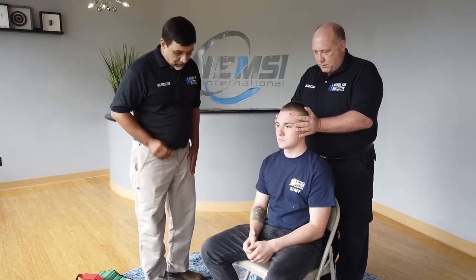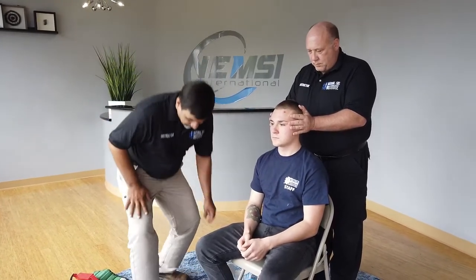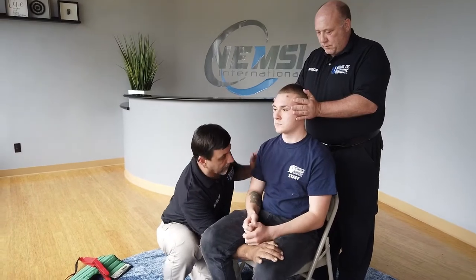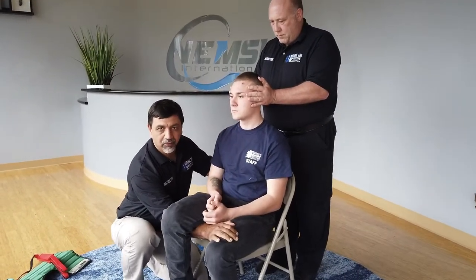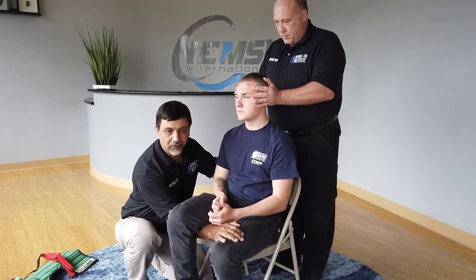We are going to have to move him forward a little bit. By doing that we are going to come to the side of him. I am going to put my far hand underneath his leg up onto his knee. My other hand will go onto the flat of his back, and on my partner's count we are going to move the patient forward.